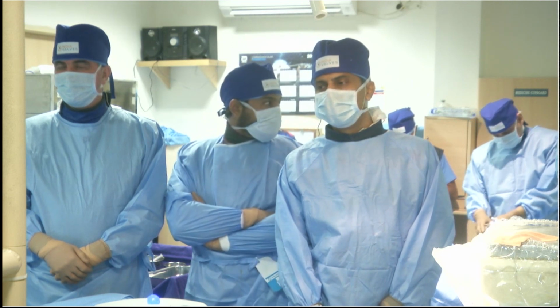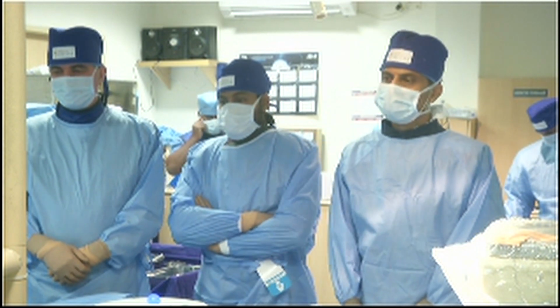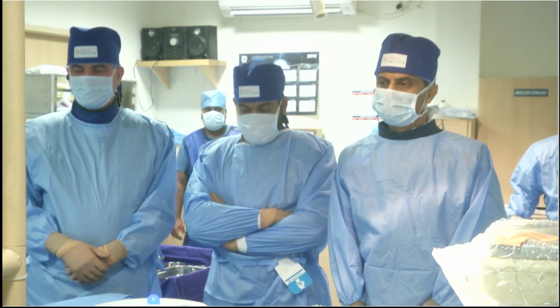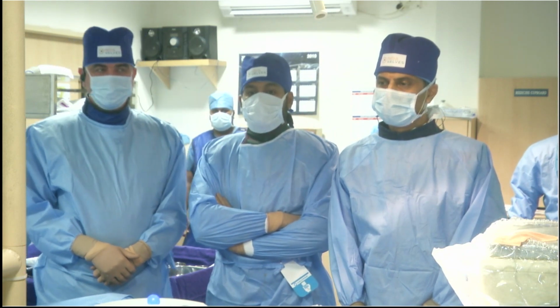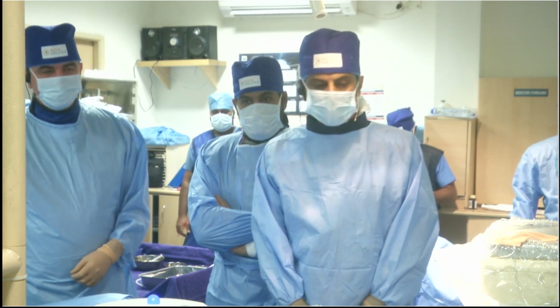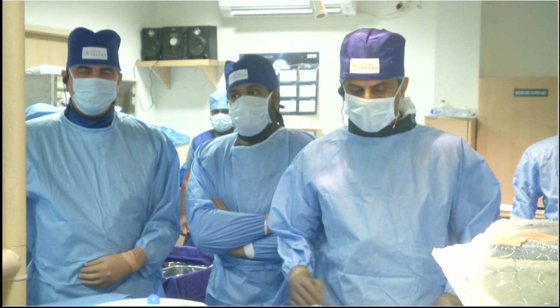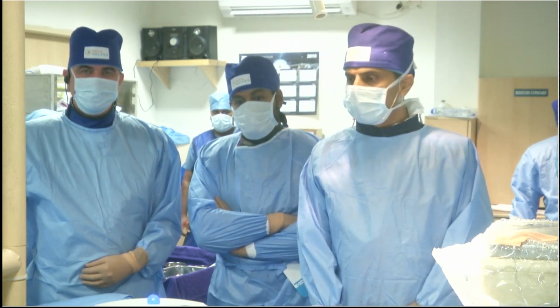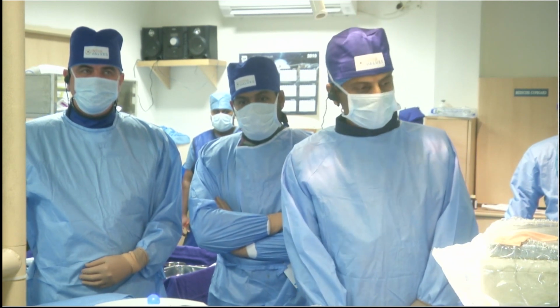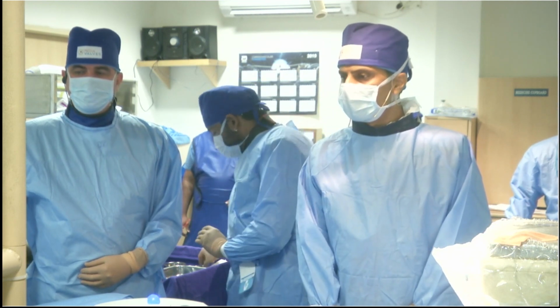So maybe we can move to the room now. They have been ready for 15 minutes. So maybe we can ask you what will be your plan for this case? Yeah. So we have seen the CT, so this patient has severe calcified aortic stenosis, a bicuspid valve. So we plan to do this by transfemoral approach and use conscious sedation. Maybe we'll give a mild sedation as the patient is a bit restless and anxious.